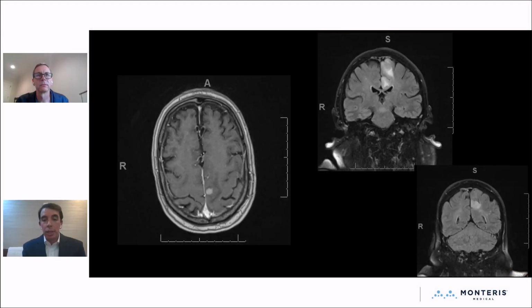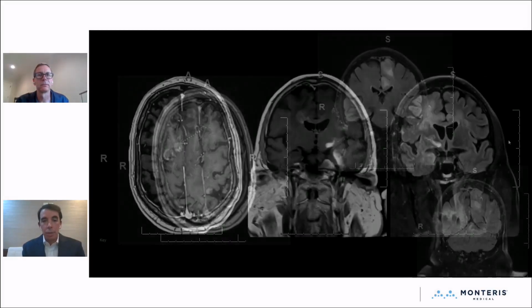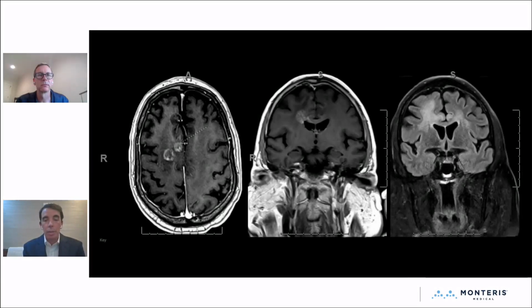So here's his initial imaging. We see a multifocal, or really multicentric lesion, which you can see on the coronal flare here, these 2 areas, one with an area of enhancement. This was biopsied, and biopsy was read as anaplastic astrocytoma. The patient was treated with concurrent chemoradiation and 4 cycles of adjuvant therapy and developed 2 new enhancing lesions, which you see here at the margin of the radiation treatment field. I think this was around the 35 gray isodose line. And so there was question of whether this was pseudo-progression or progression.